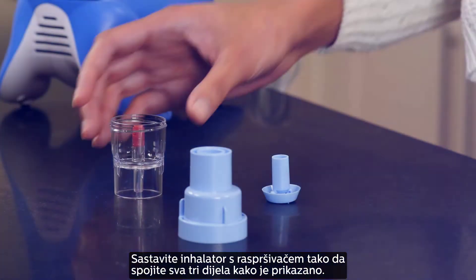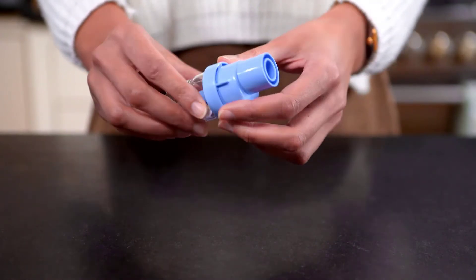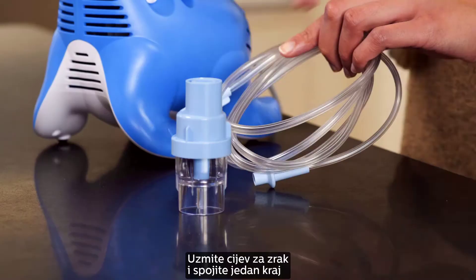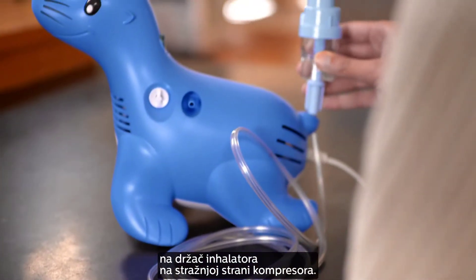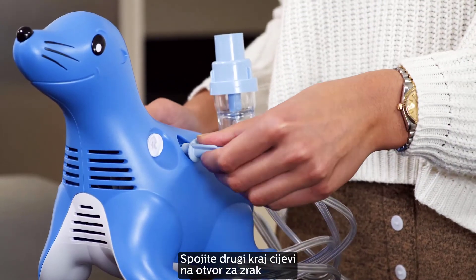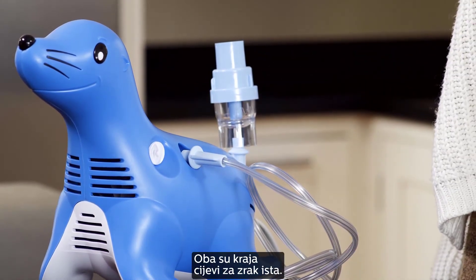To assemble the Sidestream nebulizer, put the three parts together as shown. Take the nebulizer tubing and connect one end to the bottom of the Sidestream medicine cup. The Sidestream can now rest in the nebulizer holder on the back of the Sammy compressor. Attach the other end of the tubing to the Sammy compressor air outlet. Both ends of the tubing are the same.